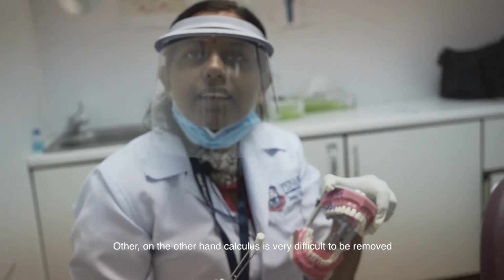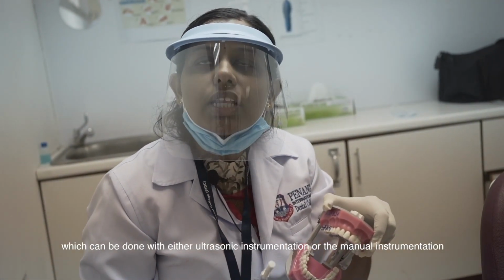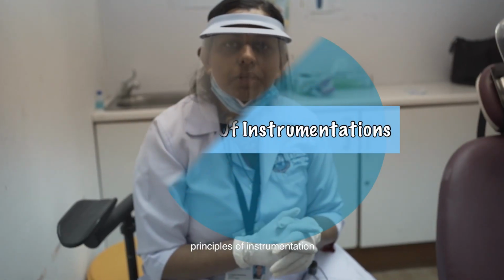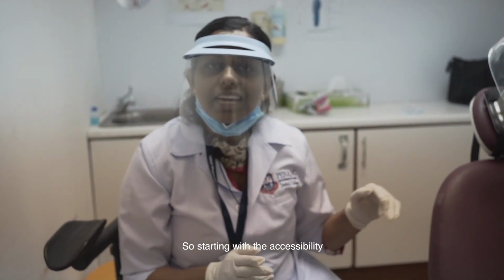On the other hand, calculus is very difficult for the patient to remove by themselves. For that, professional scaling has to be done, which can be done with either ultrasonic instrumentation or manual instrumentation. The principles of instrumentation remain the same for both manual as well as ultrasonic scaling. So, starting with accessibility.